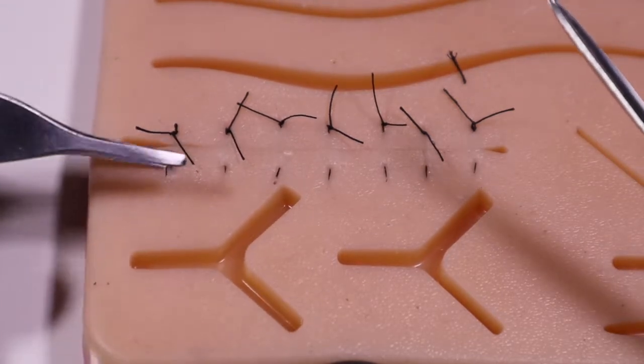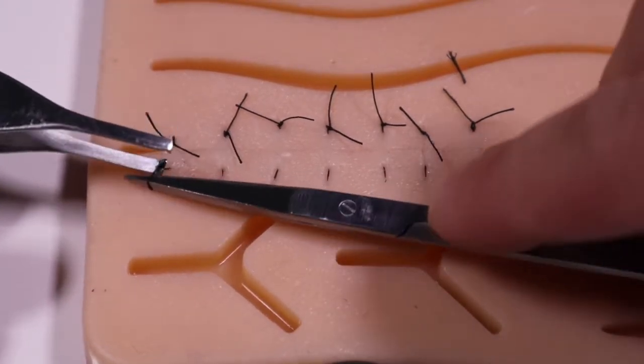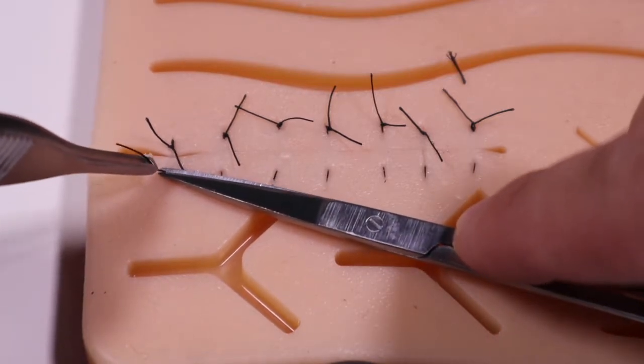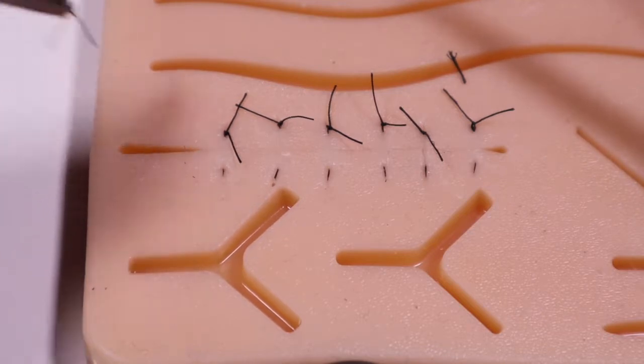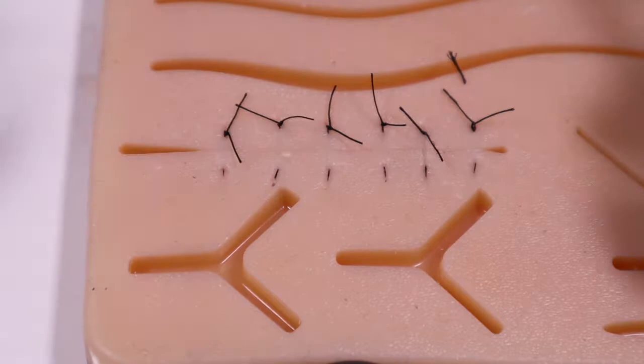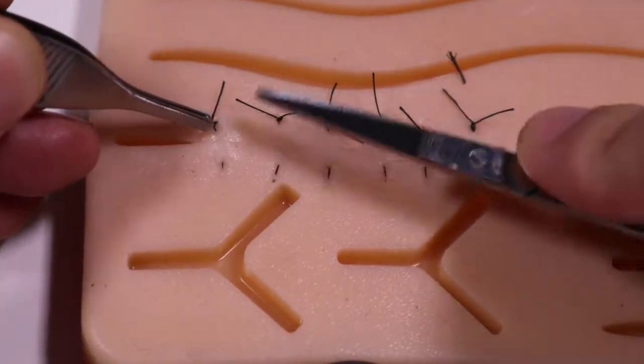See if we can get our Adson under that near suture and we will pull that through. We will cut that off, pull that up slightly and cut that off at the skin, and pull the remaining knot. No exposed suture should pull through the skin with that technique.